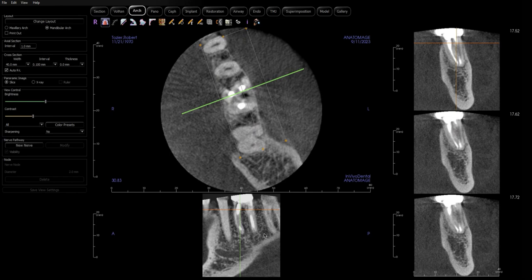Hey Doc, it's Nick. I am doing a video recording to try to show you what my thoughts are on this patient. This patient had endo done about 20 years ago and presented with some symptoms on chewing — essentially just sensitivity to function.